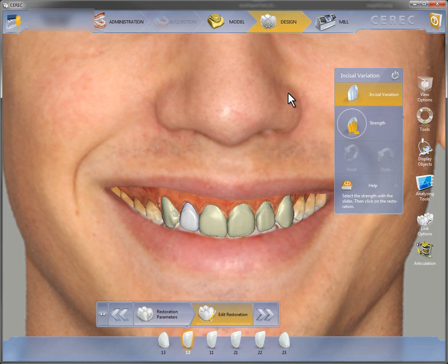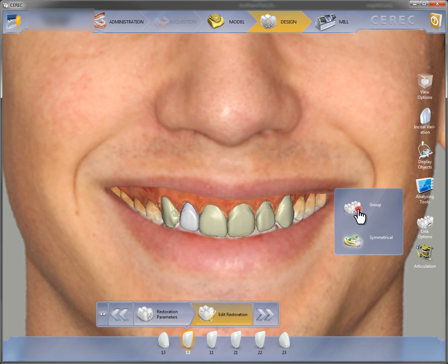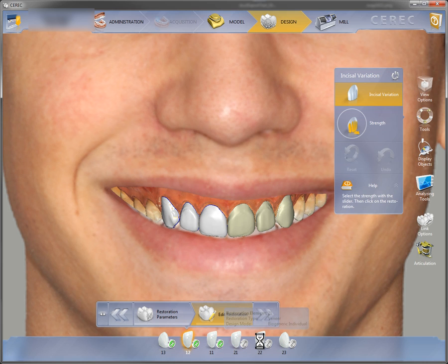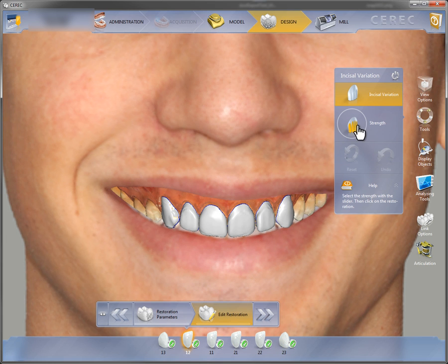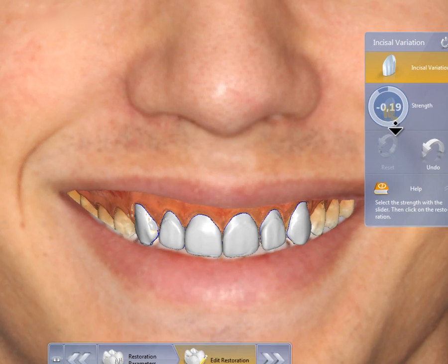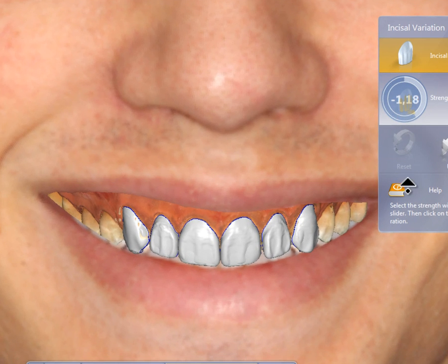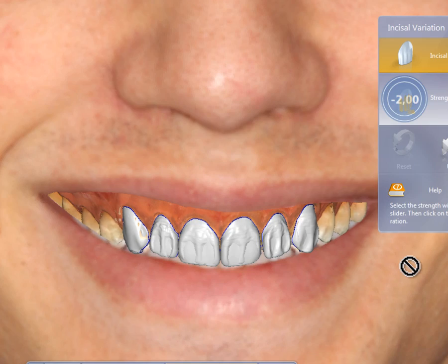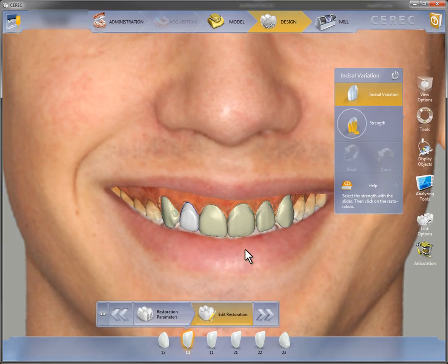In this case, for instance, we use the symmetry tool or the group tool. This allows us to change the entire front in one go and we see this entire front in real time. The incisal variation tool, for example, lets us visually see the cutback technique on all of the front teeth at the same time.